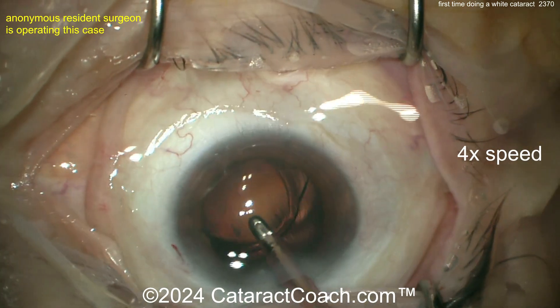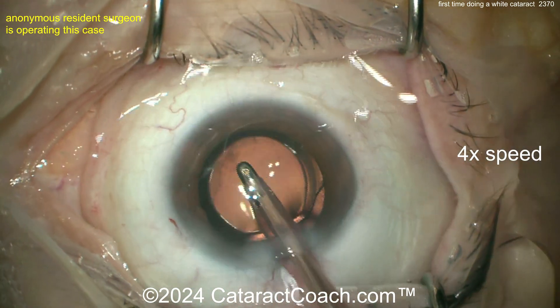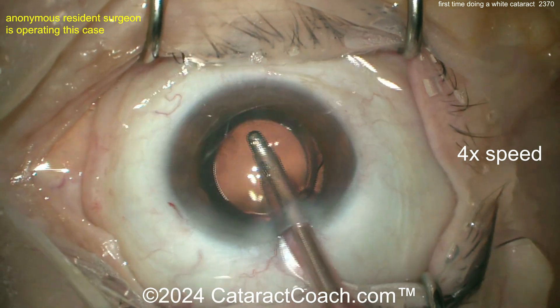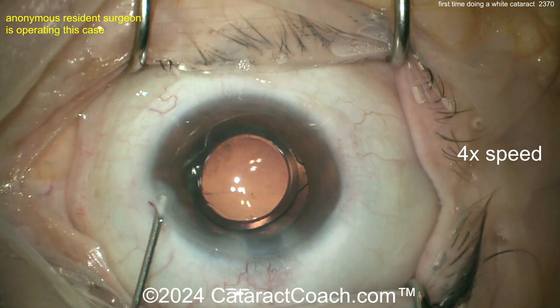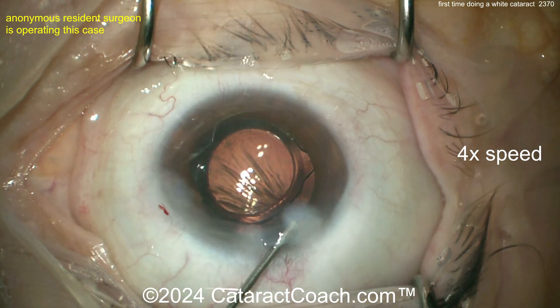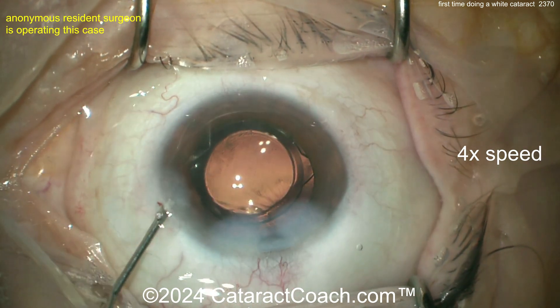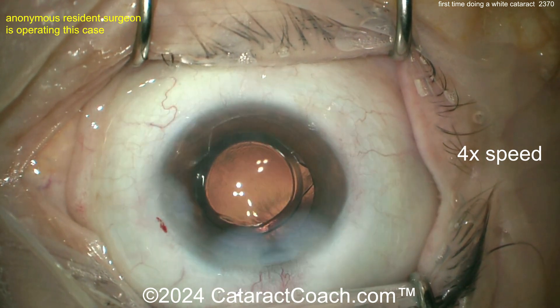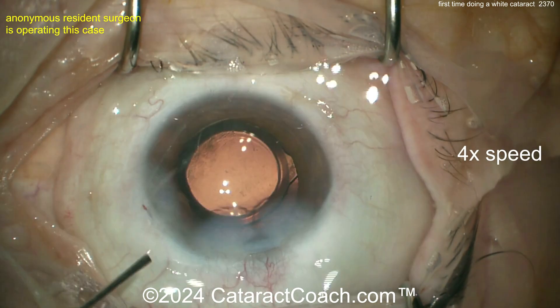Should a resident use that video overlay to judge capsulorhexis size? Sure, why not. I use forceps marked at 2.5 and 5 millimeters from the tip to help judge size. If you want to use this video overlay to get a great rhexis, go for it — the proof is in the pudding. The result was great.